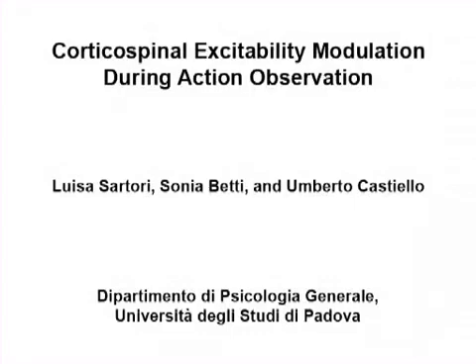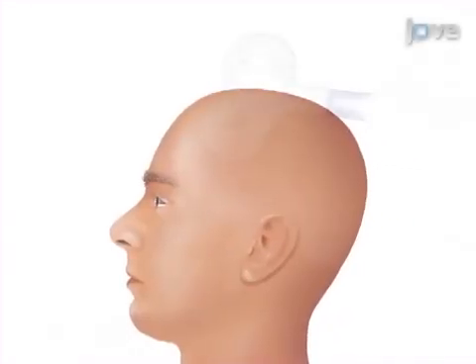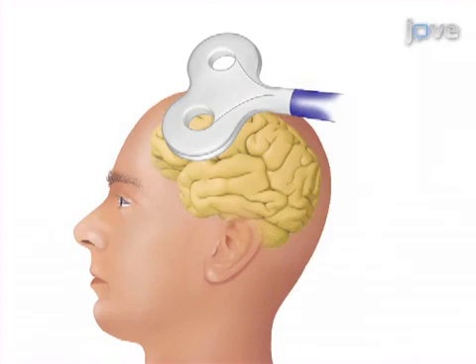The overall goal of the following experiment is to explore corticospinal excitability changes induced by action observation in interactive contexts, to identify when the automatic tendency to emulate someone else's action becomes the preparation for a non-identical response. This is achieved by using single-pulse transcranial magnetic stimulation over the primary motor cortex to assess corticospinal excitability with a relatively high temporal resolution.